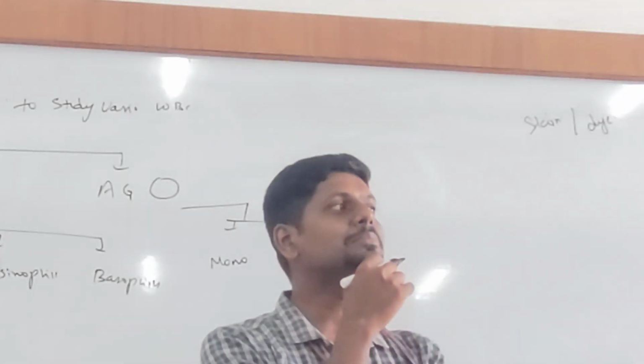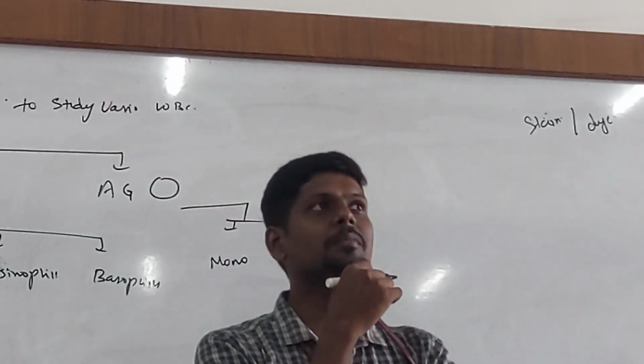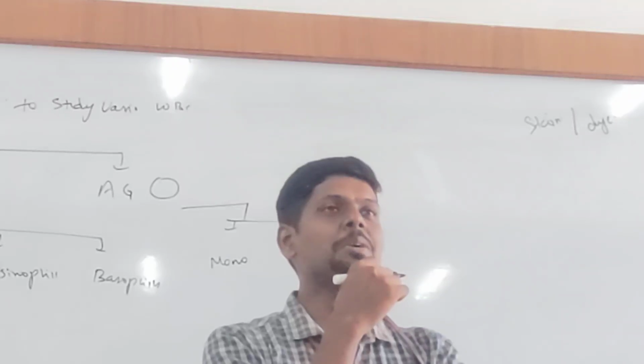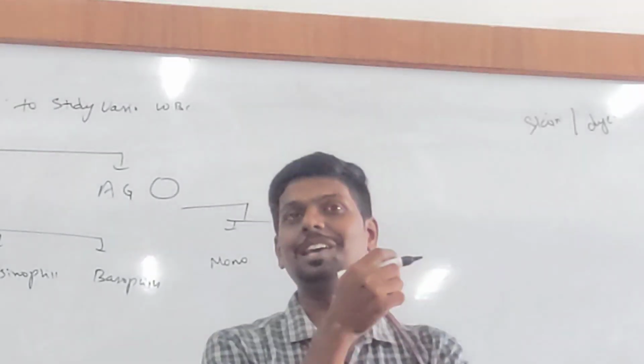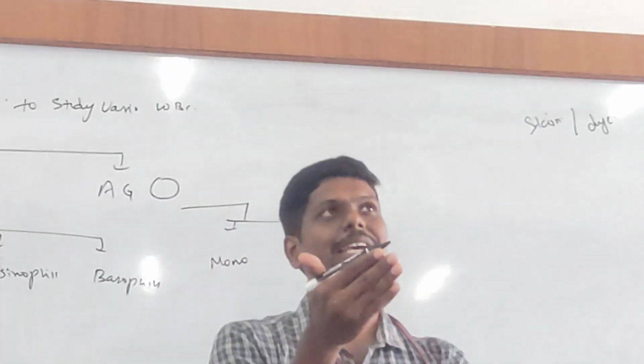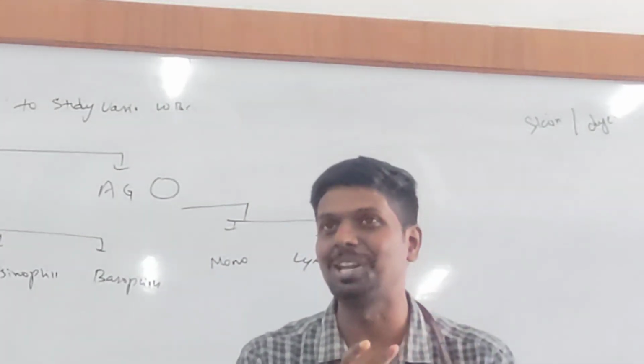Dye is a thick color, but when we visualize it under a microscope we can distinguish between cells. So she is saying scientifically a stain can stain the cell.